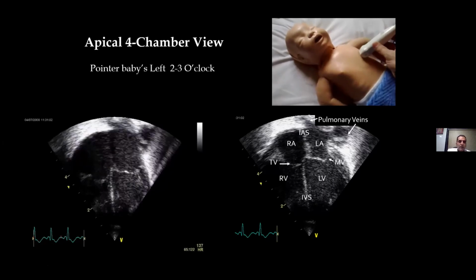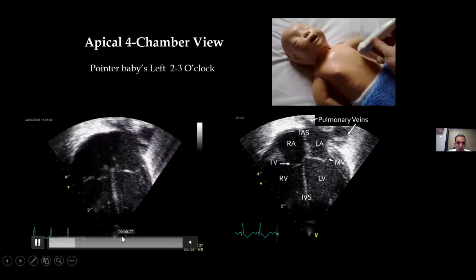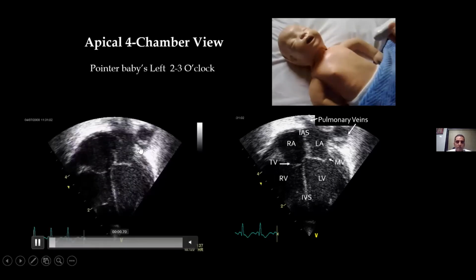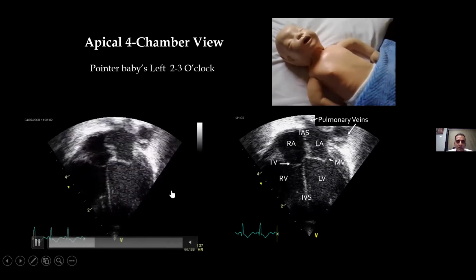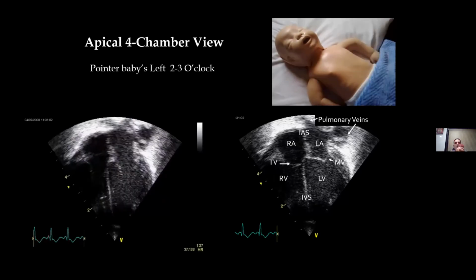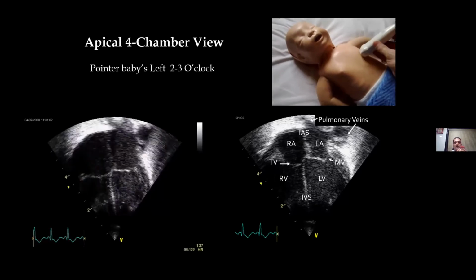Okay. Now you can ask me why this thing is upright, why this probe orientation marker is down here. In adult cardiology, they put this inverted up, but this is an inverted image. What we have done is an apical 4-chamber view. We have made it upright, anatomically corrected, because as we all know and shown, the ventricles are down, atria are up. That's how we imagine the heart.